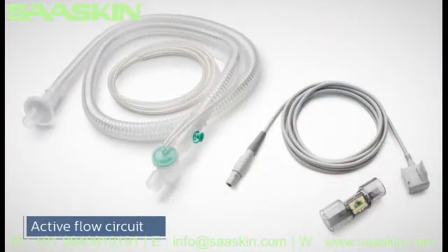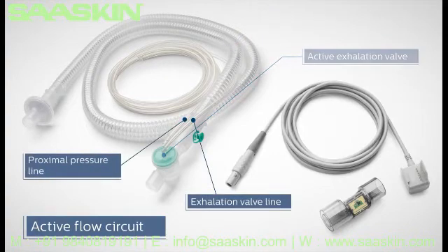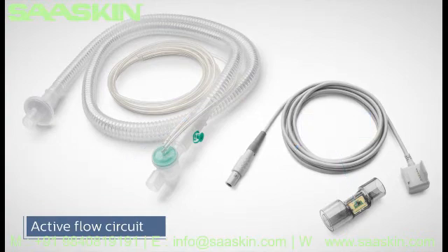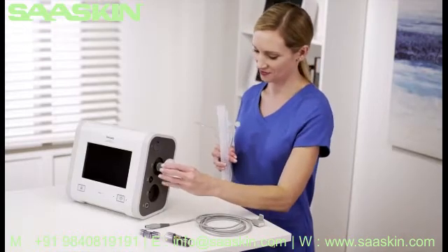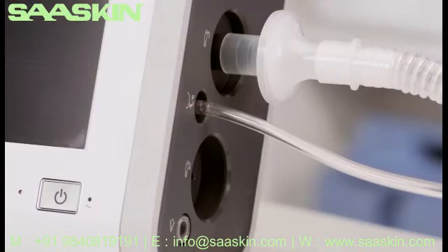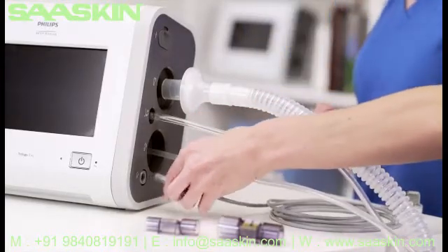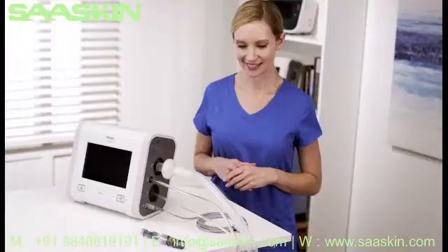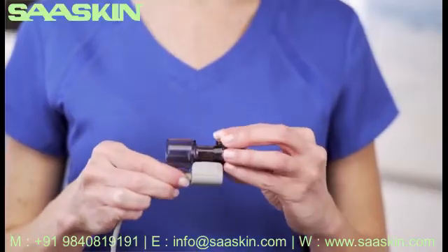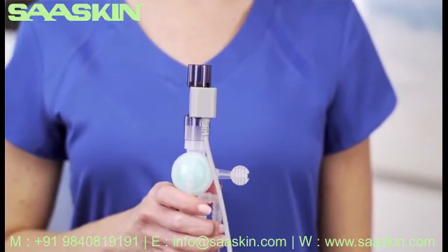The active flow circuit consists of a bacterial filter, tubing, active exhalation valve, exhalation valve line, proximal pressure line, flow sensor, and cable — essentially the active PAP circuit with an added flow sensor and cable. Connect the bacterial filter and tubing to the inspiratory port. Attach the proximal pressure line to its port and the active exhalation valve line to its connection. Now attach the flow sensor cable into the connector located towards the bottom of the device. Attach the appropriate flow sensor — adult, pediatric, or infant — to the cable, clip shut, then attach the flow sensor to the active exhalation valve on the circuit. The active flow circuit is now complete.